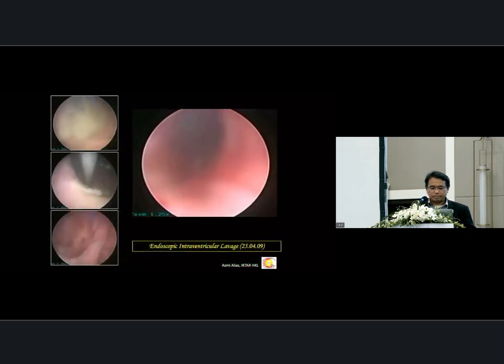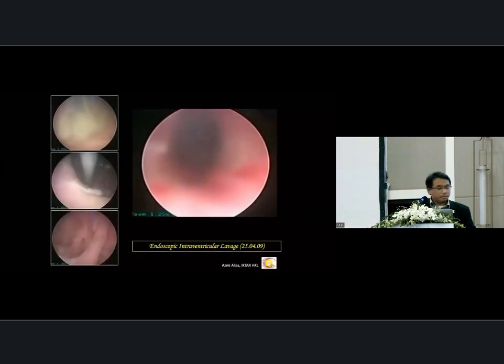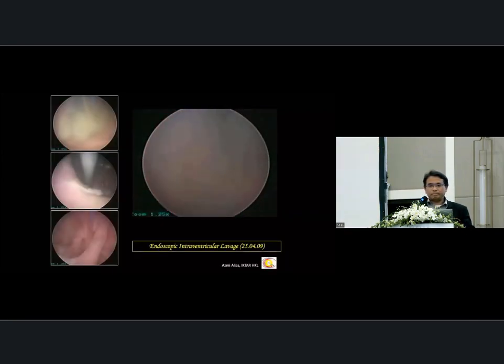So what we do, we make a typical ventriculostomy into the ventricle. Now we use the infant feeding catheter, and we aspirate the pus first. You see that it's quite easy using this infant feeding catheter, because you can know what is going inside your catheter. Then we go to the floor of the third ventricle, and you start to see the interthalamic mass. Once we have cleared the content, we start the irrigation. Because if you start the irrigation too early, the pus will be thrown everywhere. Then you have a snowstorm. You don't want to do that because you will lose the ependymal target.